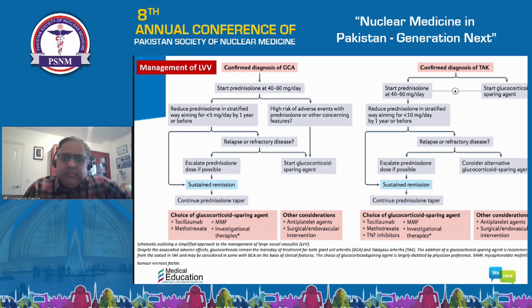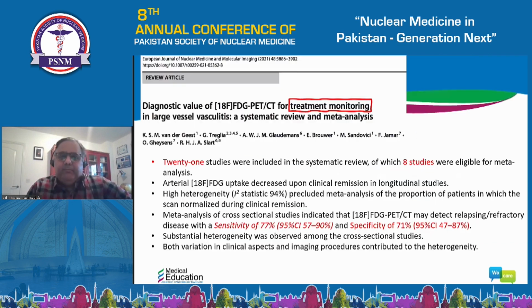Now here, I put the slide with the emphasis on the treatment options at the bottom. In the last row, you can see these pink boxes: treatment with glucocorticoid and glucocorticoid sparing agents, immunotherapy, methotrexate. FDG was always there, been there for quite some time. What has made it useful for vasculitis? Treatments. Once we have treatments for certain things, treatments with good outcomes, imaging and diagnostic modalities become very crucial. Next slide.